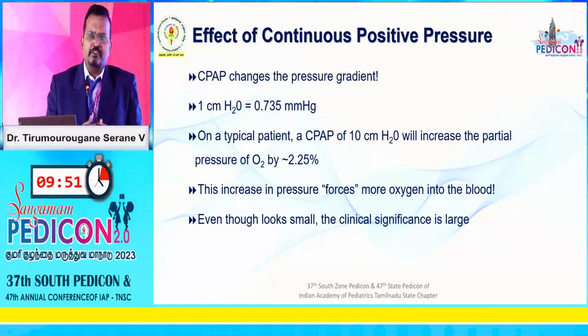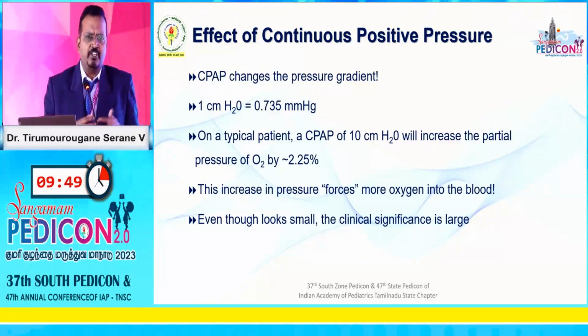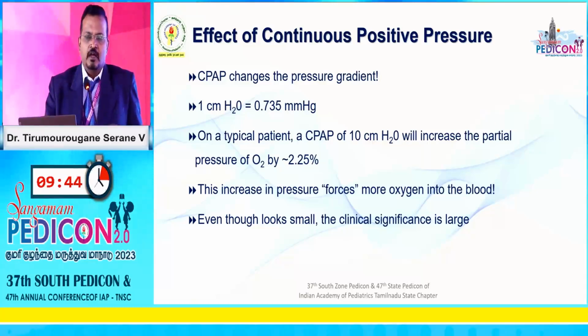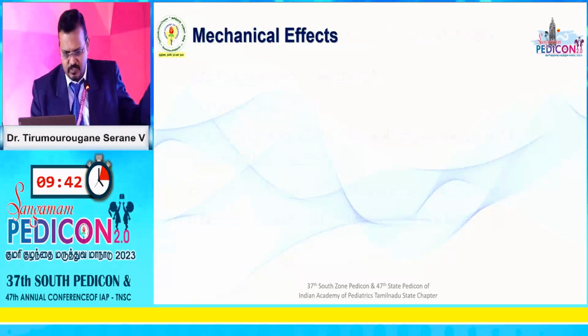How many times have we seen babies who have just been put on CPAP, initially no saturation, and within a matter of 2 minutes, the saturation has gone up to normal. And the reason it happens is because of this.